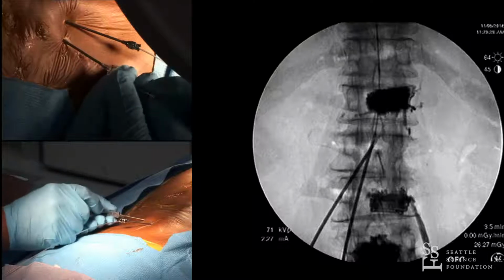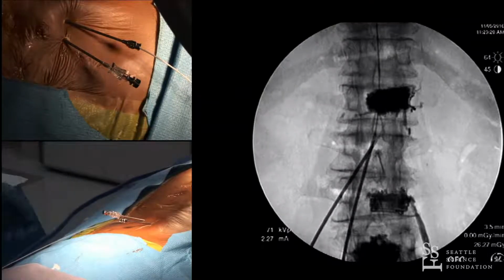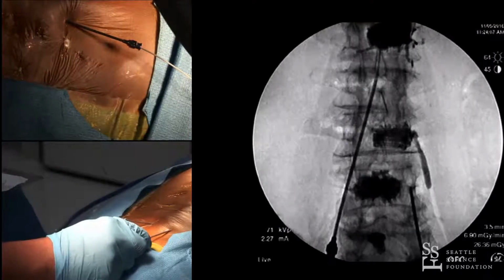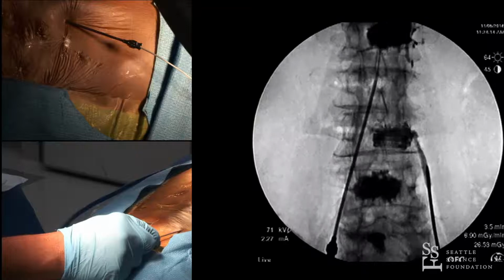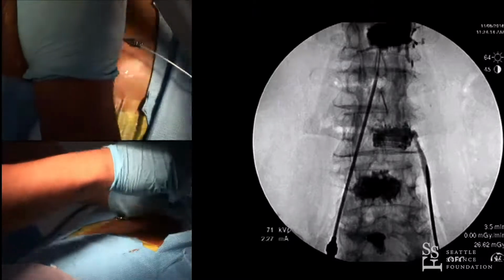Let's come down south and see if we can find anything. So each one, I can see now why you're doing vertebroplasty here. It's a lot of cement in the way here. Let's go on the other side, actually. So starting down again about 2 levels below, aiming for the contralateral side now.